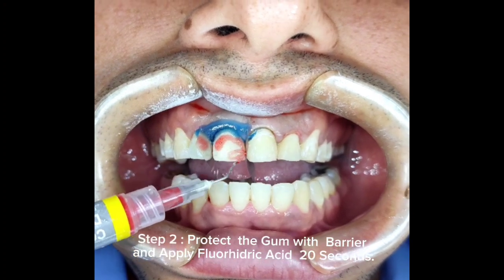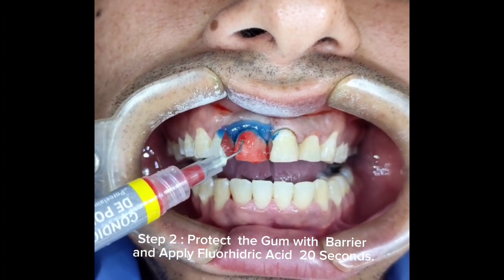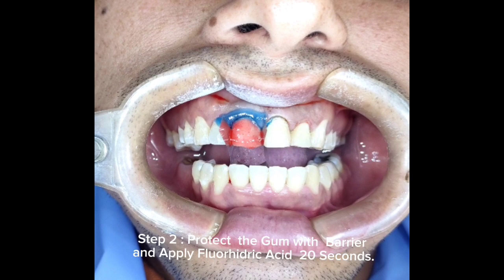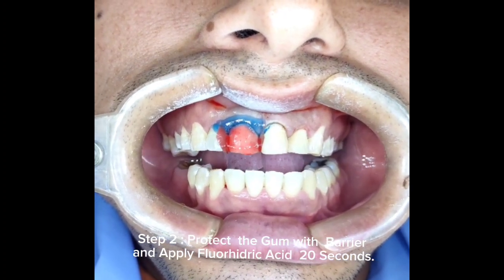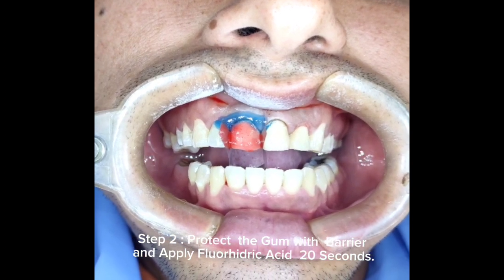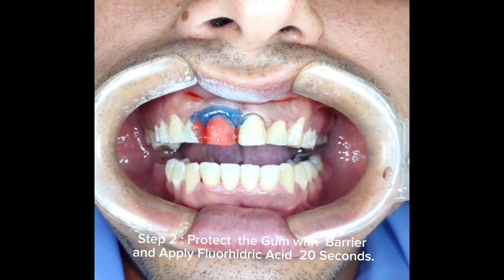It's important to put a gum barrier before applying the acid. Fluorhydric acid is the name. This is a special acid to etch porcelain. Remember, fluorhydric acid 8%, left in place for 20 seconds. You need to take a lot of care not to touch the gum. For this reason, you need to use a gum barrier.